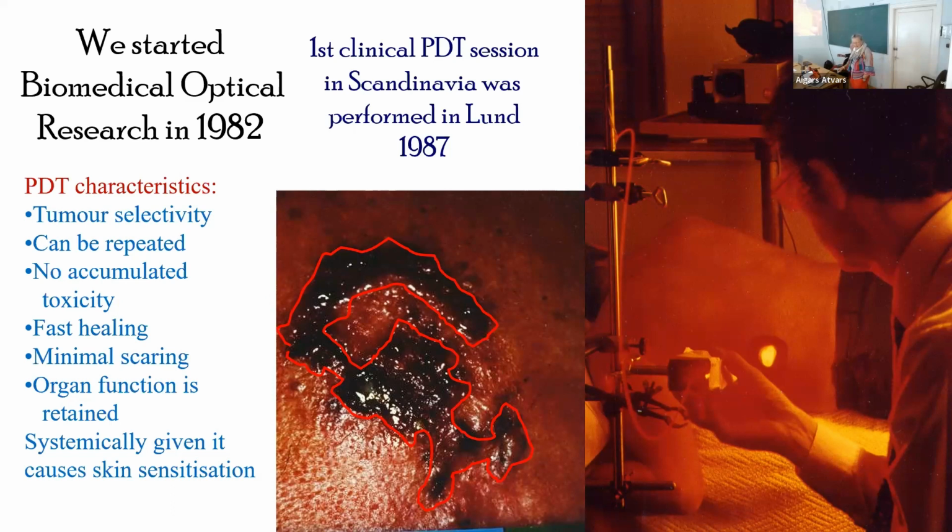You also see Professor Svanberg here with a lot of nice hair. Anyway, this is the first patient that we treated with a technique which we call photodynamic therapy. It's interesting to see that this is a selective treatment modality, because this area was illuminated with light all over here, and still you see that there is a selective necrotic formation.